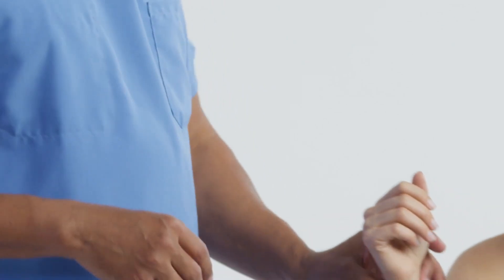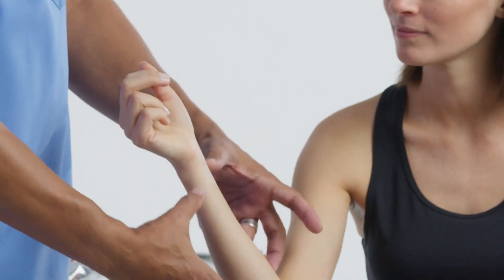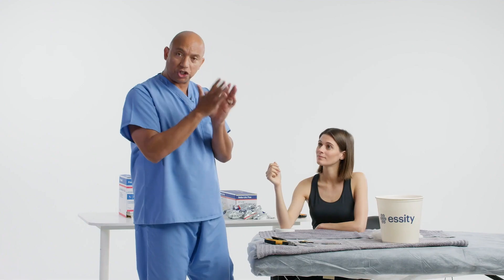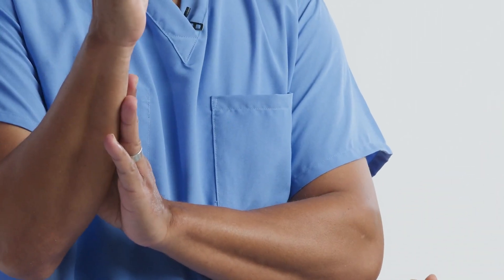When we get ready to do this, we make sure we talk about something. When we do our mold, we'll focus on the forearm, not in the articulating area of the wrist where the nerves are. So we'll concentrate on our mold, putting a gentle mold on that to make a flat impression on the dorsal and volar aspect of the cast.